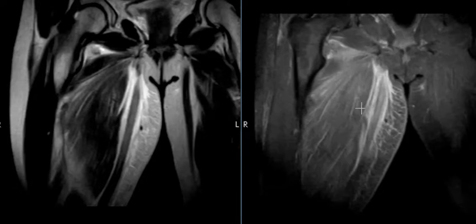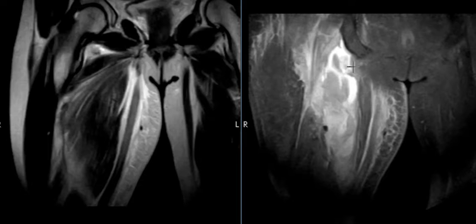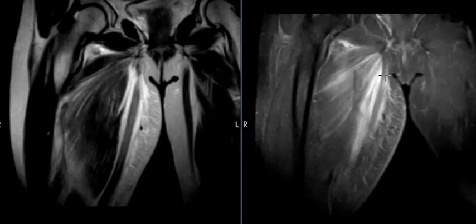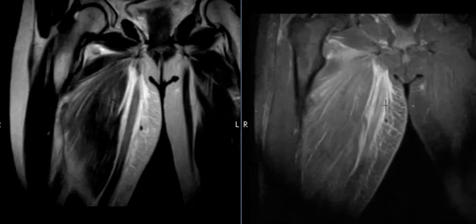So this is an adductor muscle strain, a ruptured hamstring tendon that's retracted back with a big hematoma, and that cannot heal because it's too far away. So they're going to talk to her about surgery. And they also have this partially torn muscle here, the gracilis, which is again part of the pes anserine tendon complex. Now, interestingly, I almost never mention the gracilis.